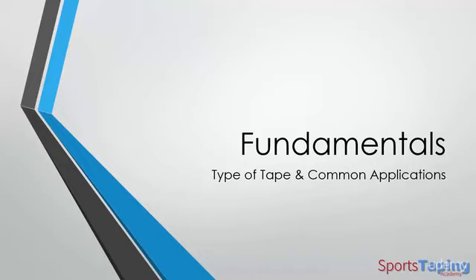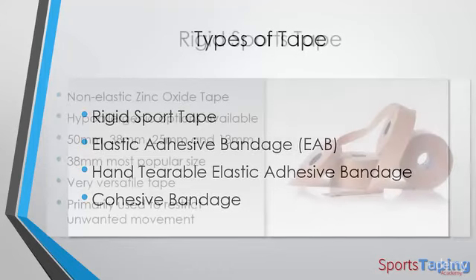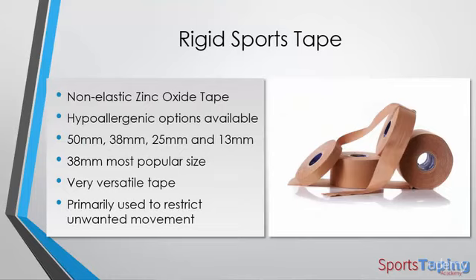Types of tape and their most common applications. So we're going to discuss rigid tape, elastic adhesive bandage, otherwise known as EAB, hand tearable elastic bandage, and we're going to finish off this section with cohesive. To get started, let's have a look at rigid tape, also known sometimes as zinc oxide or non-stretch.